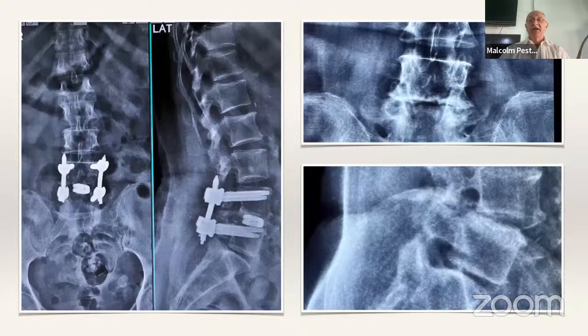See this image. This image is of a patient who had a previous laminectomy, has come back to me after 30 years with a listhesis, pain, wanted a surgery, done it beautifully by a para-UB approach once again, removing the facet from outside to inside. I straightaway land up in Kambin's triangle. The cord shifts away. I don't need to do any stripping, burring, pushing, nothing. So it becomes so easy to put in a cage, flip a cage, make it horizontal, put it across the midline and jack it up.